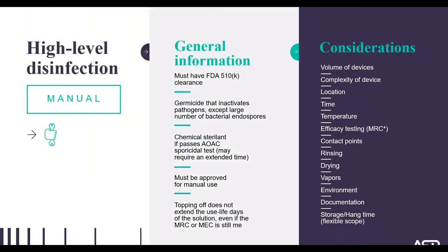So let's talk a little bit about manual high-level disinfection. I associate manual high-level disinfecting with IUS, immediate use steam sterilization, or flash sterilization. You're like, what? How do those two relate? Well, meaning you only do it when there's no other option. Well, why? Because of the challenges.